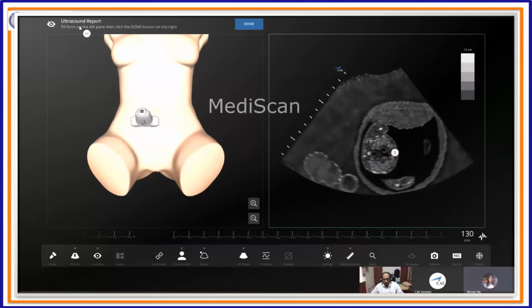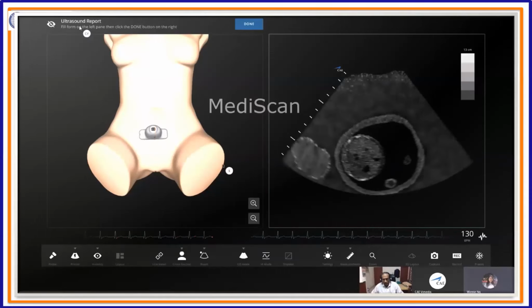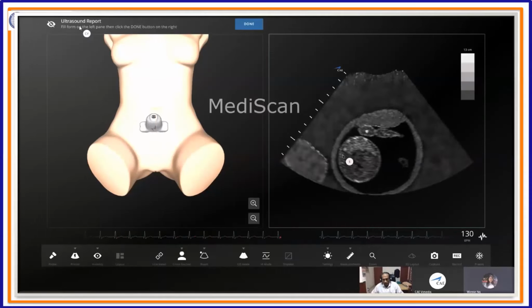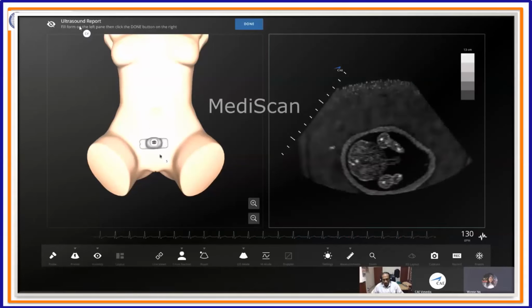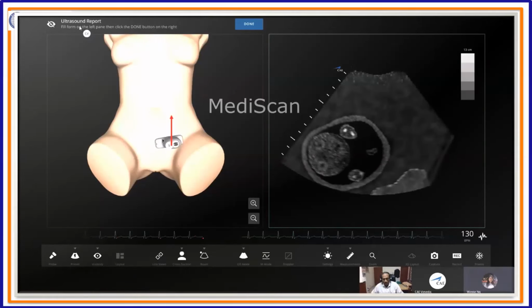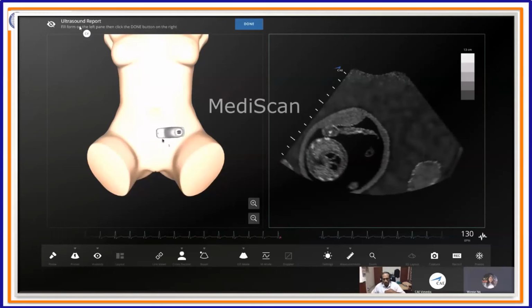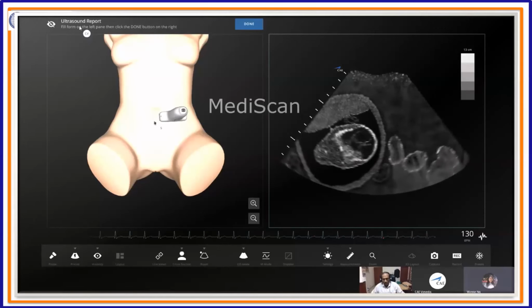As I'm watching, I'm actually looking at one fetus. I'm seeing the head of the baby there. So let me come down and then move to the midline. From the midline, I keep moving the probe upwards. Again, I'm seeing only one fetus, the same fetus again. And I move up to the left and move again to the same activity. So deliberately, I'm just moving my probe 1, 2, 3. That's how I cover the entire length of the uterus.